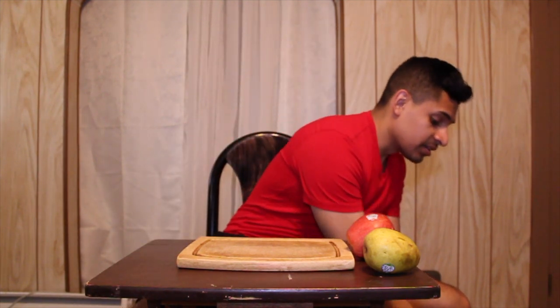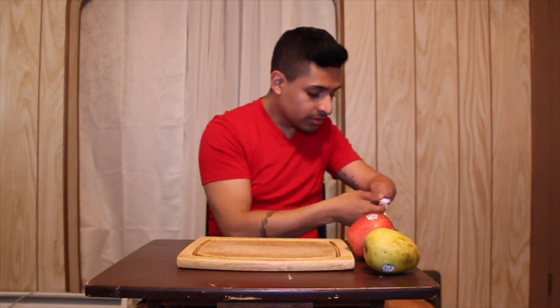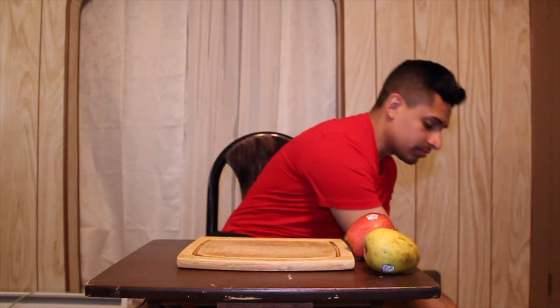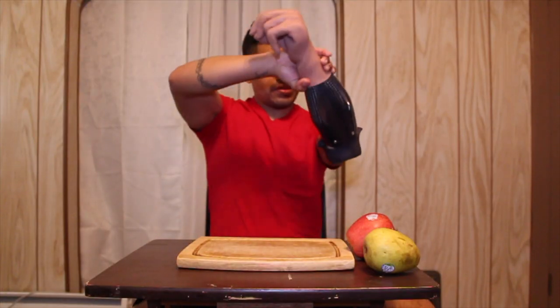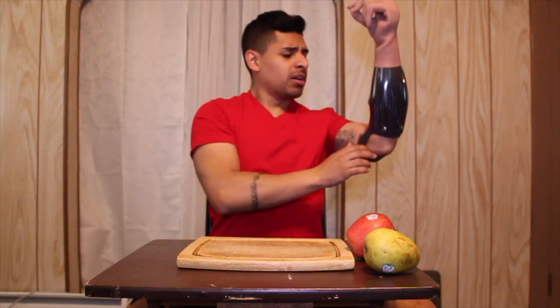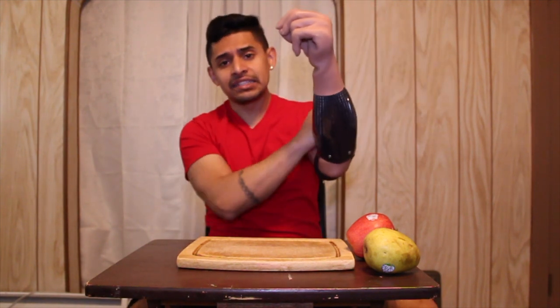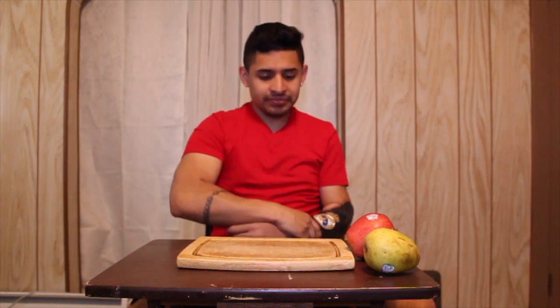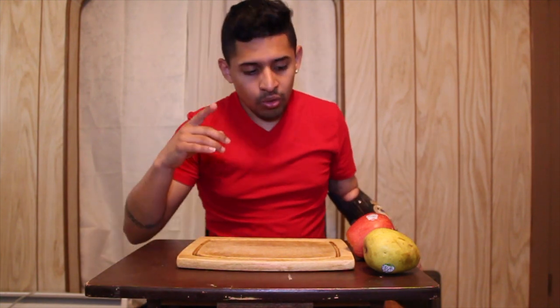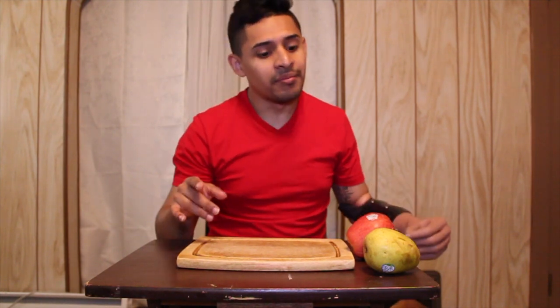First I have to put on hand sanitizer so I can put the prosthetic on. There you go — oh, too much hand sanitizer. Okay, there you go. How it pops on my arm.